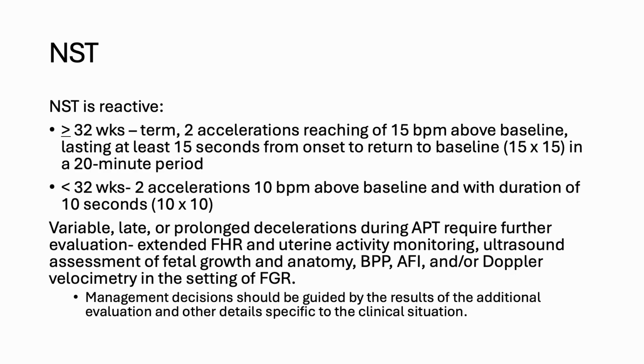So that's 15 by 15, and this would have to happen within a 20-minute period. I've worked with MFMs, and they say you don't need the full 20 minutes if you already have 2 accelerations. You can take them off when they have 2 accelerations, but you would need to go with your practice at that point.